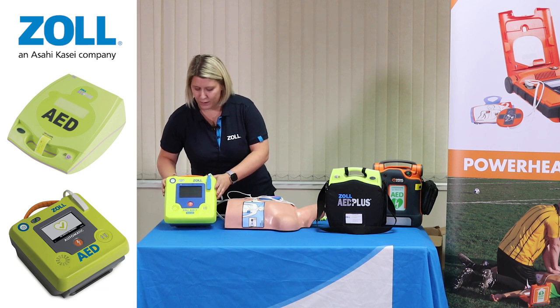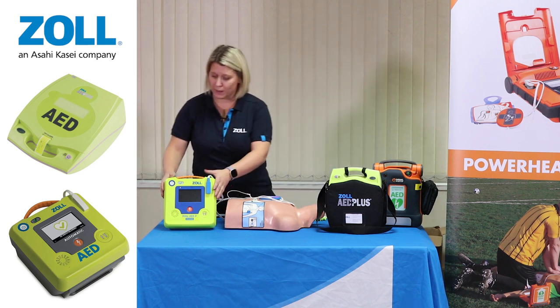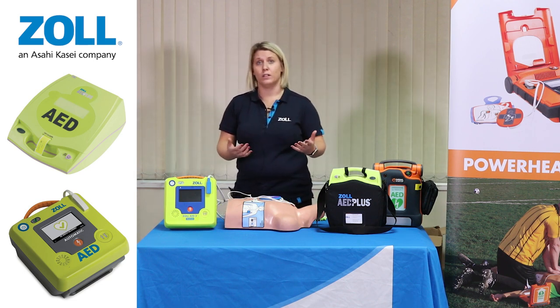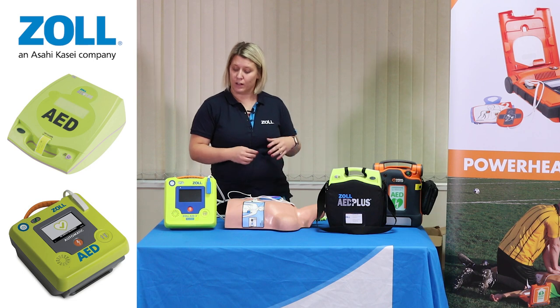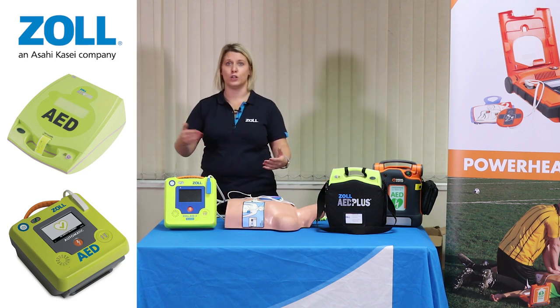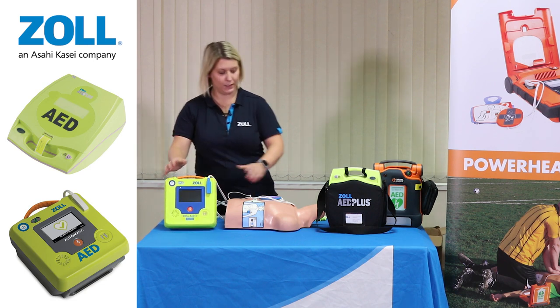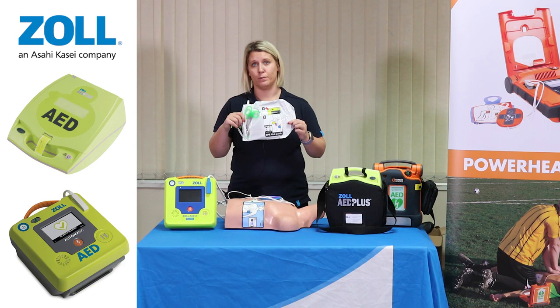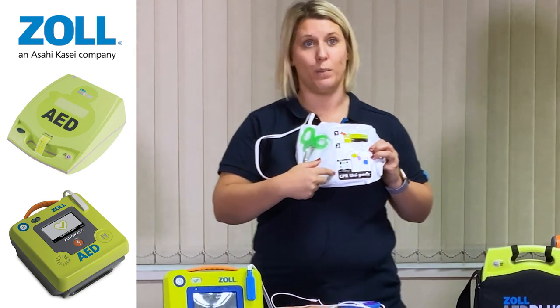So what I'll do is turn the device on. We come in two types of models for this particular unit — a fully automatic or a semi-automatic unit. If a device is semi-automatic, you simply push the button when prompted. If the device is fully automatic, it will advise you that a shock is required, to stand back to ensure the environment is safe and that nobody's touching the casualty, and then it will deliver a countdown: shock advised, please stand back, shock will be delivered in three, two, one. In terms of the paediatric functionality, the pads can be used on a paediatric patient or an adult patient, and they come with tough-cut scissors to remove clothing, along with guidance on what to do depending on the type of patient you're treating.